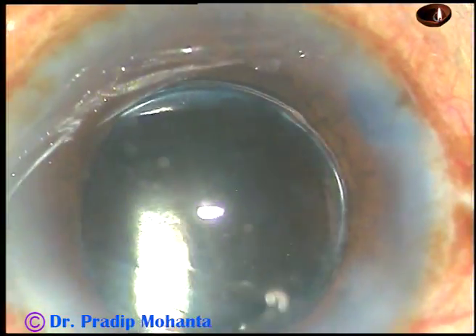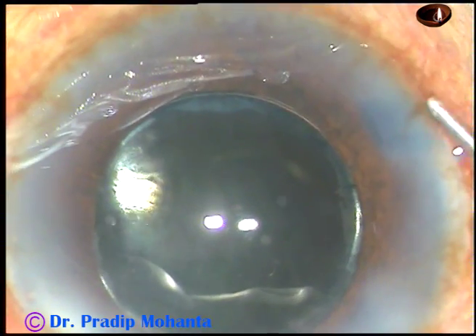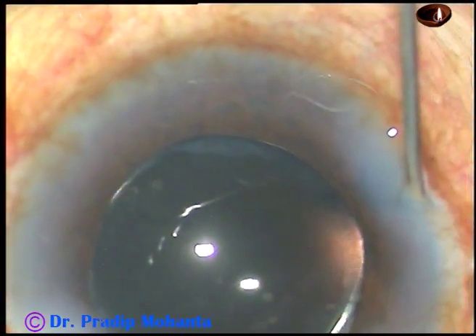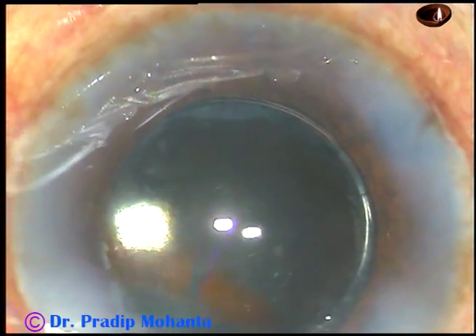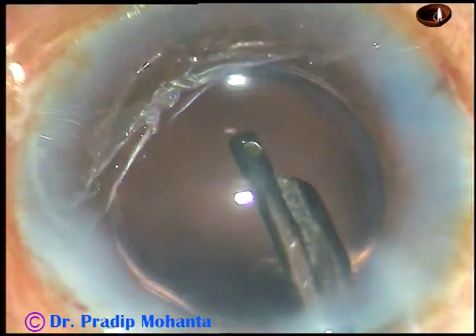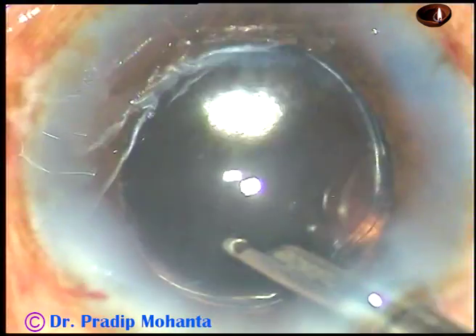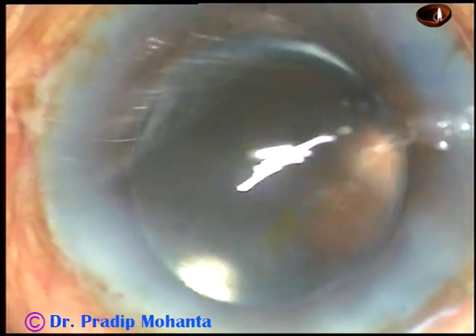The capsule is covering part of the optic all around, so this is a very nice rhexis. Now the paracentesis incisions are closed by hydrating the stroma on either side of the incision so that these stab wounds become tight. This is the final lavage of the anterior chamber.